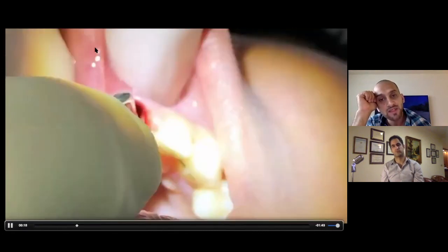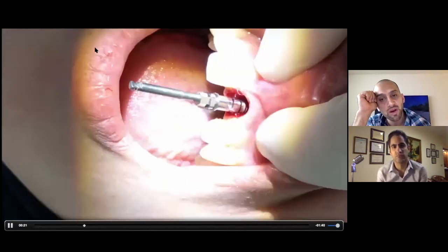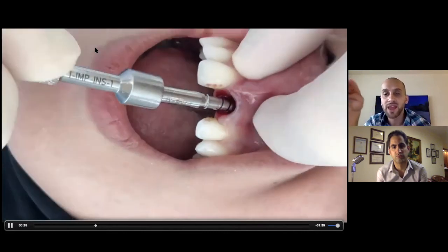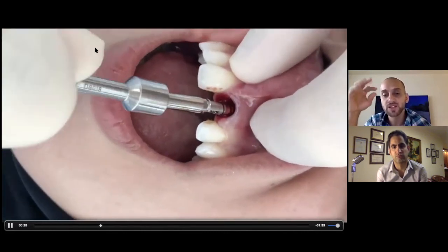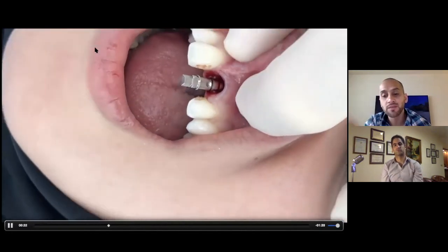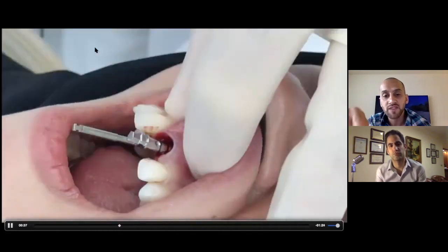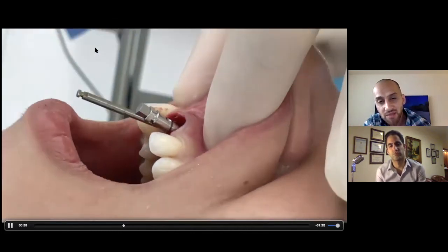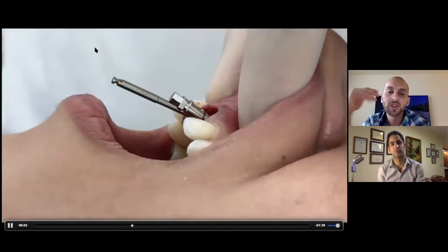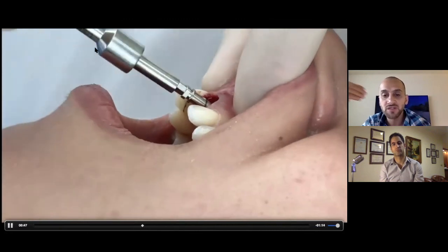That's why for these coaxis implants, it's very important to follow a strict surgical protocol. So it's important for the implant to be inserted palatally to where the apex is, and then the stability starts forming. When we talked about burying that implant 3 millimeters deeper than the gingival zenith of the adjacent side, these fixtures have these lines. You can see that line by the dimple. That line must be in line with the gingival zenith, which means that the implant is going to be 3 millimeters apical to the gingival zenith of the adjacent side.